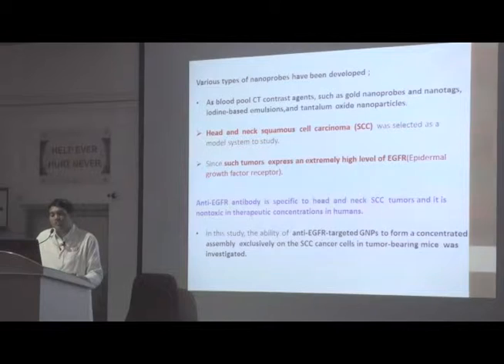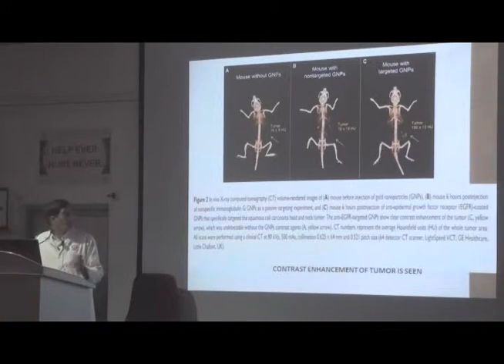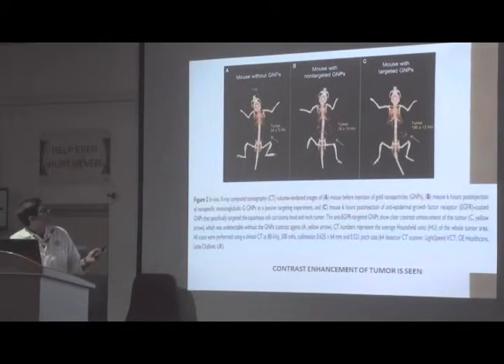So we are using anti-EGFR antibody. By using this image, we can see this is the mouse without gold nanoparticles. This is the mouse with the non-targeted gold nanoparticles, and the mouse with the targeted gold nanoparticles. You can see the enhancement of contrast of the tumor in this.